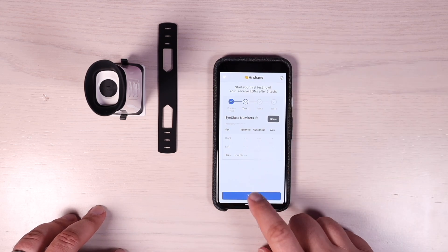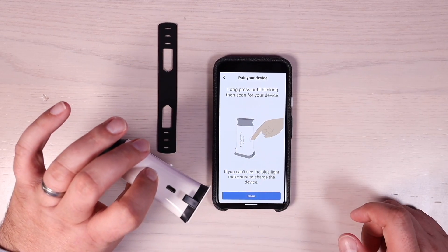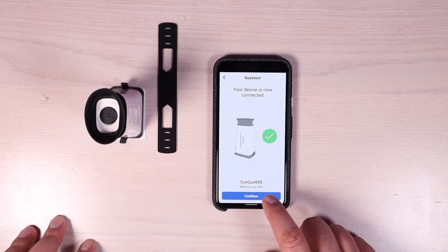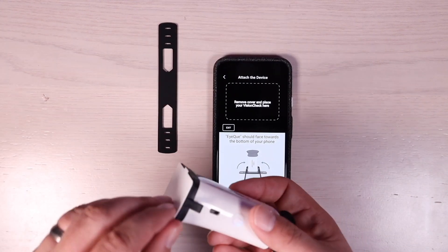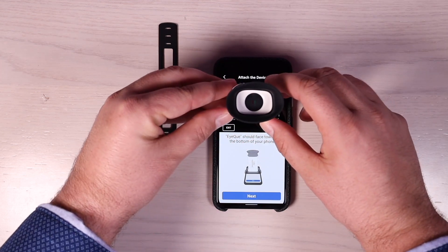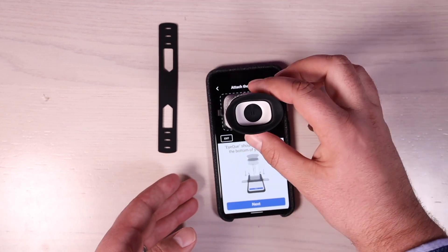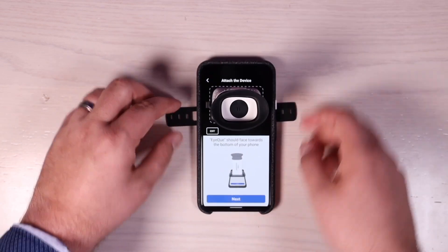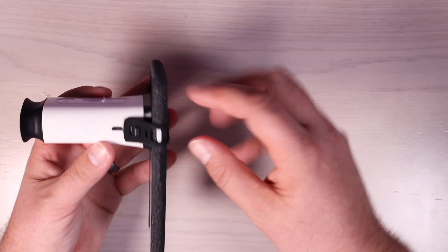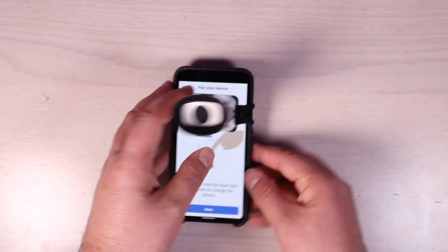Click 'Test' and begin. Power the device on so it can make the Bluetooth connection — it sees the device, so go ahead and select that. With an 89% charge we'll continue. Now remove the cover and place the device down with the buttons facing the top of your phone, making sure it's lined up within the dots. It has a suction cup action so it holds onto your phone, and then further attach it with the rubber strap by hooking it in on either side. On the Pixel 5 the strap goes over the volume rocker, which works great.